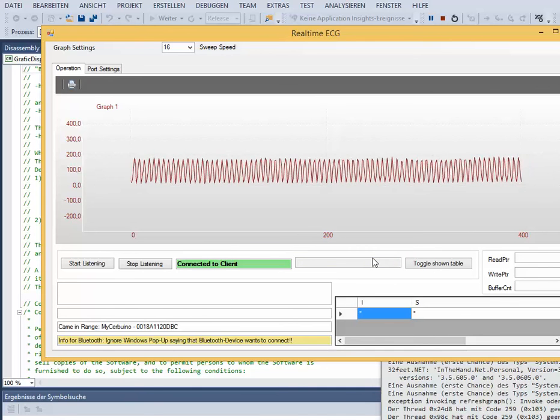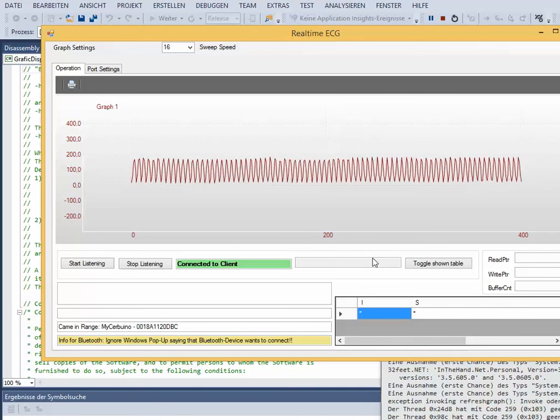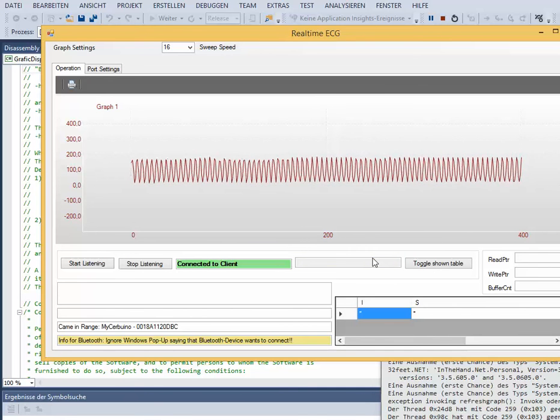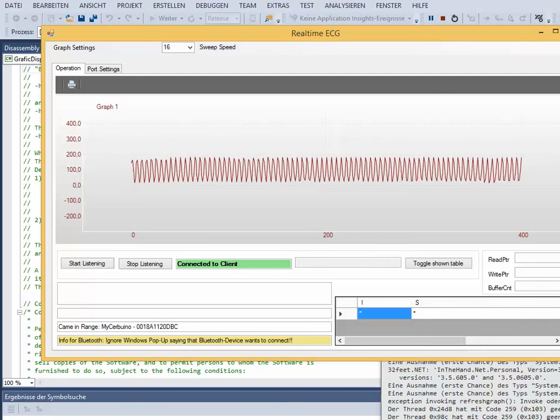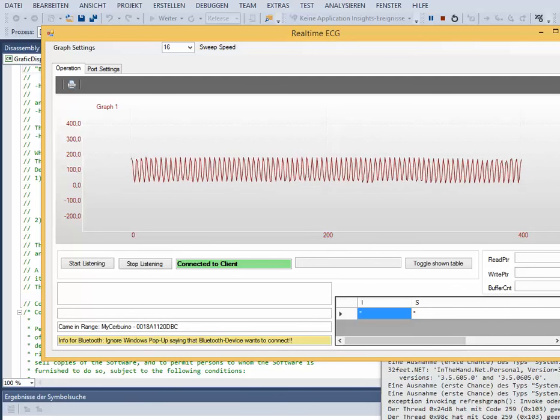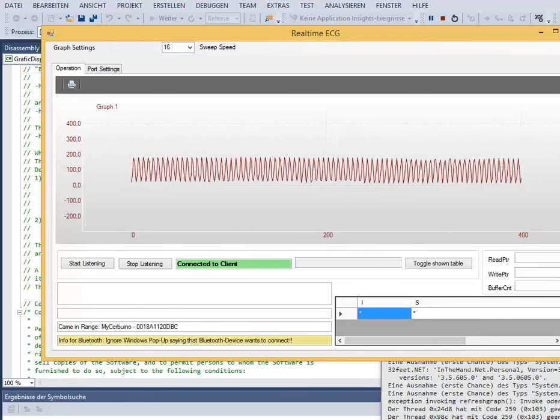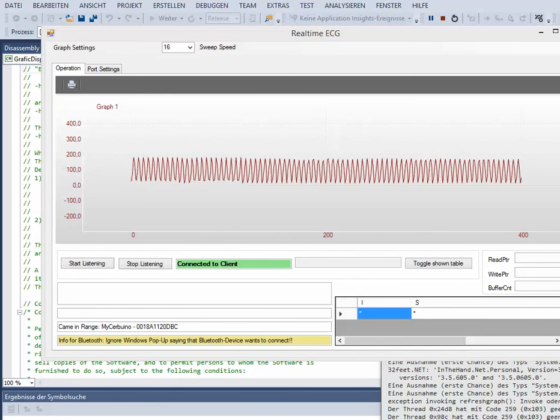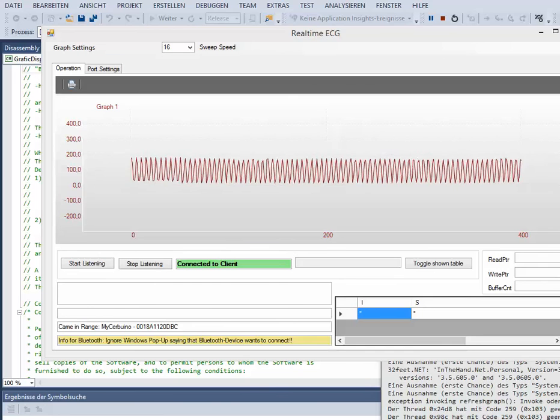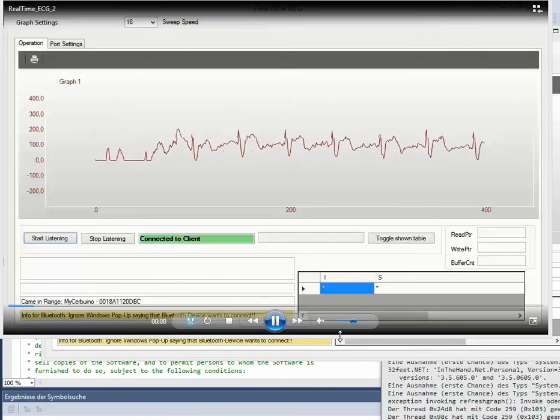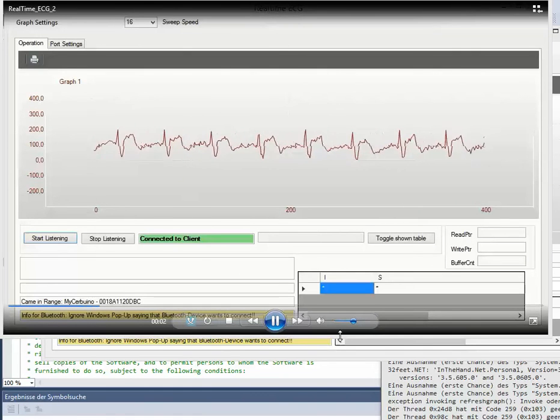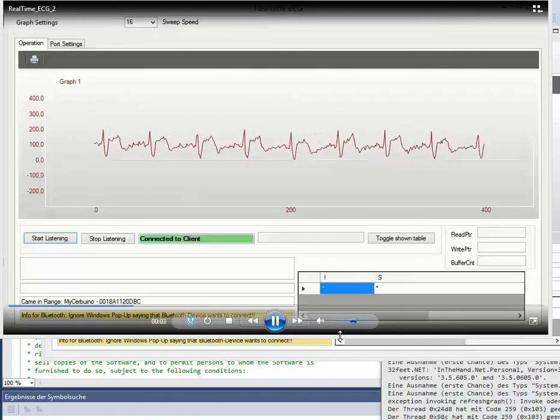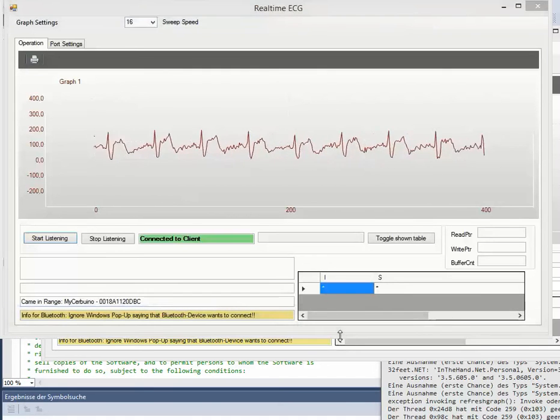Now we see the real time signal. This is the real time ECG signal.